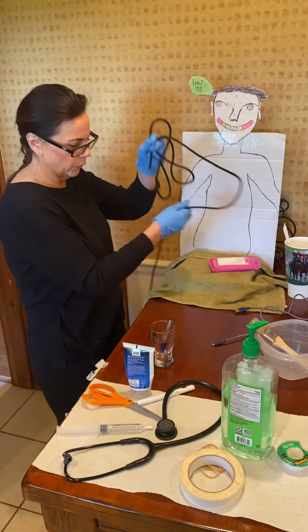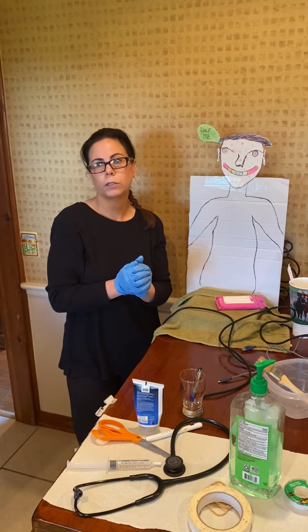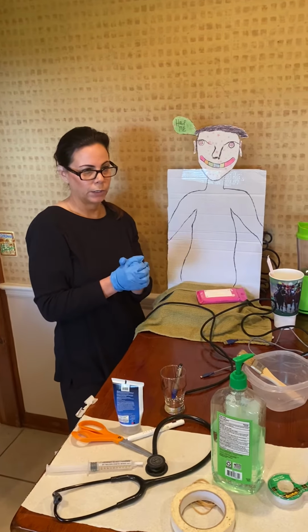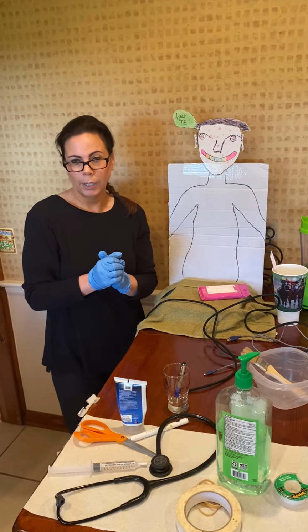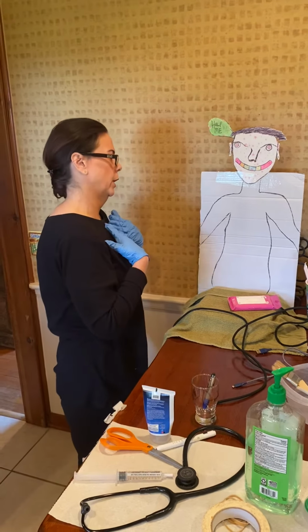So I've got my little pH measure here. The pH needs to be 4.0 or less, and this reads about a 3. A little bit of coffee grounds. Looks like we're good. We're not in the lungs. We got back like 30 milliliters, let's say. And so that looks good. I'm then going to confirm placement, and we do that ideally by x-ray. And I'm going to assess for any sort of respiratory distress or issues like that.